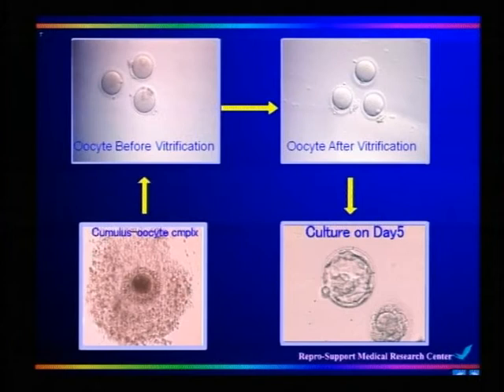You mentioned GV oocyte. How about granulosa cell? Granulosa cell? We have to give partial denuding. Will the granulosa cells survive? No, only 50%, almost half. Half will survive. Yes, half is enough. Okay. So after vitrification, and after giving ICSI, about 50% of fertilized oocytes develop to the blastocyst like this.